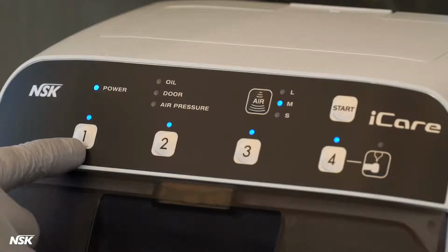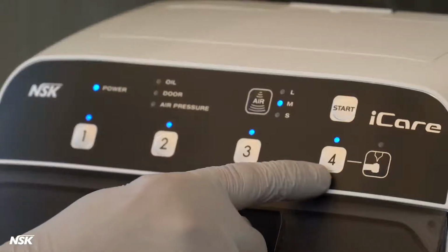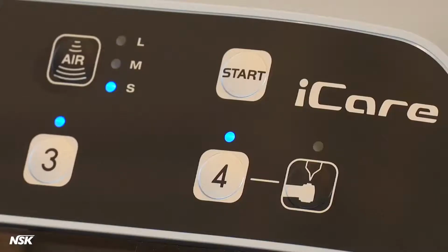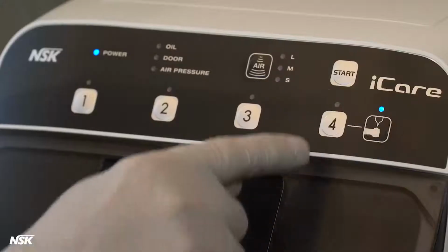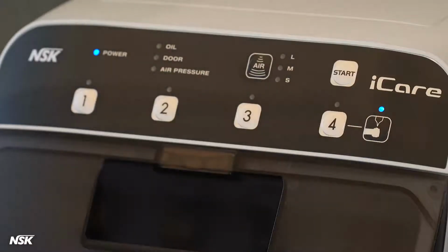Port Select button. This button activates or deactivates the port by pressing it. When lubricating, only activate the ports where a handpiece is connected. Chuck Cleaning button. This button selects the chuck cleaning mode. When this is pressed, the other ports are automatically deactivated and the machine is ready for the chuck cleaning process.